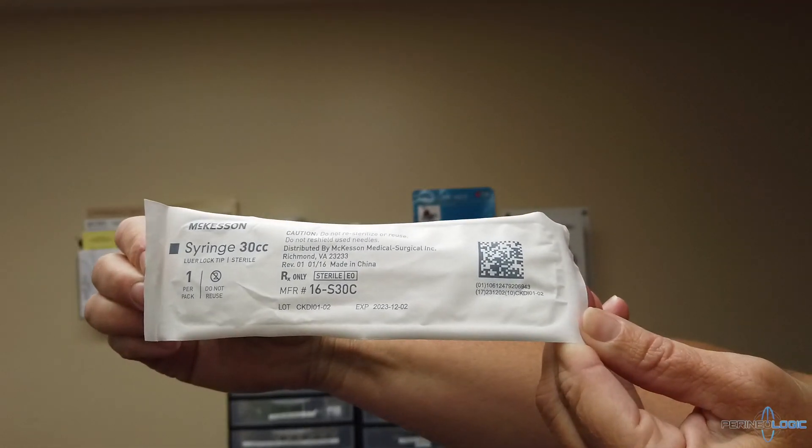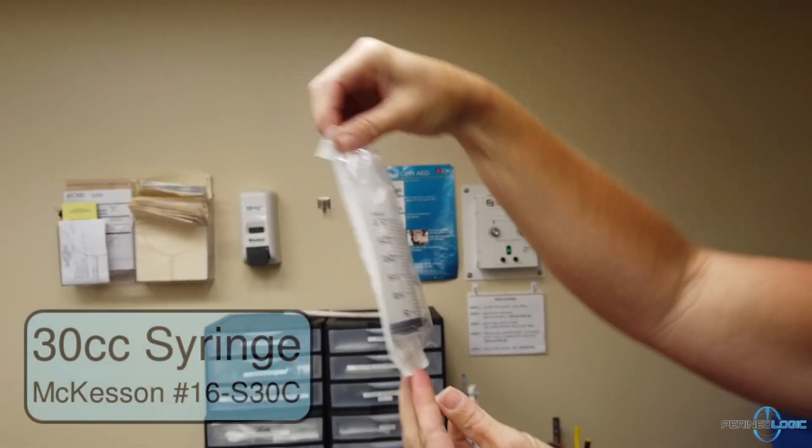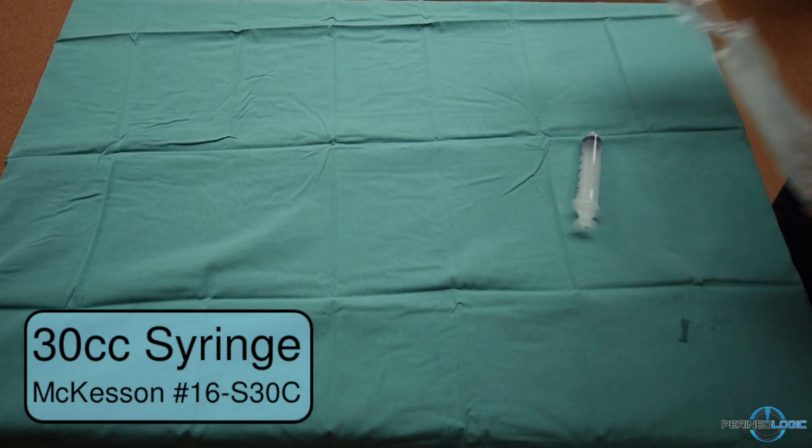First is a 30cc syringe which will be filled with 20cc of 1% lidocaine. This will be used for the local block.